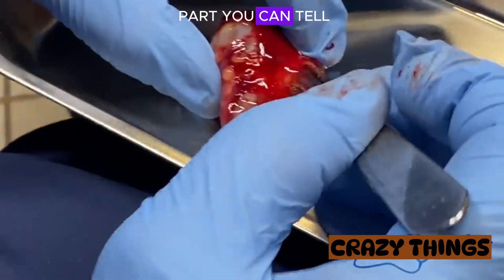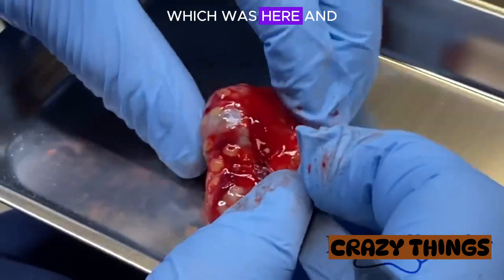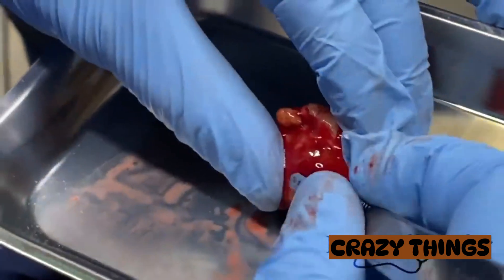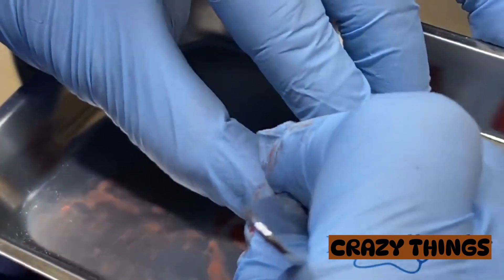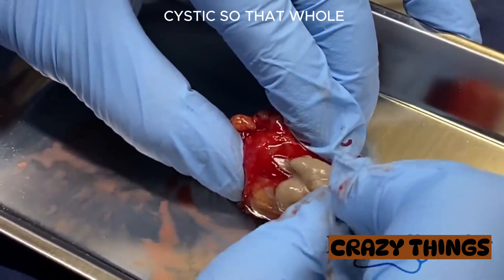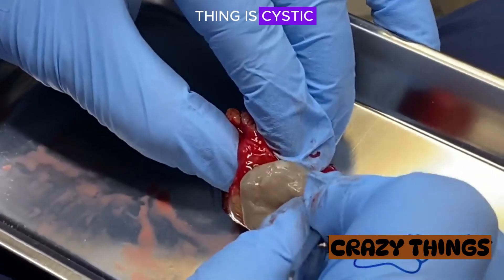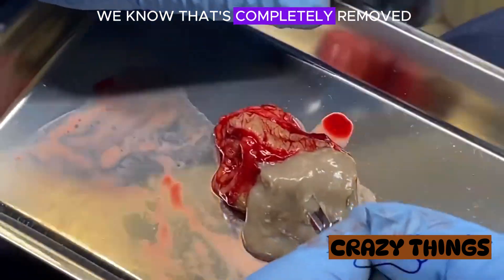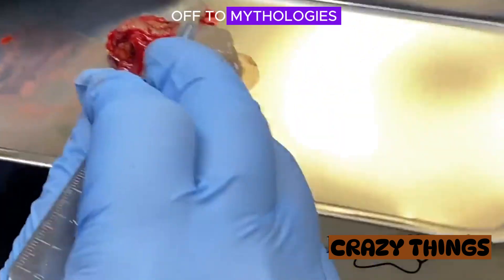So this is the part you can tell from the outside where it looked like it had a secondary lobe, which was here. Now whether this is full — let's take a look. Yeah, so it's all cystic — that whole thing is cystic. This is why I try not to rupture it, so we know that it's completely removed. We'll send that off to the pathologist.